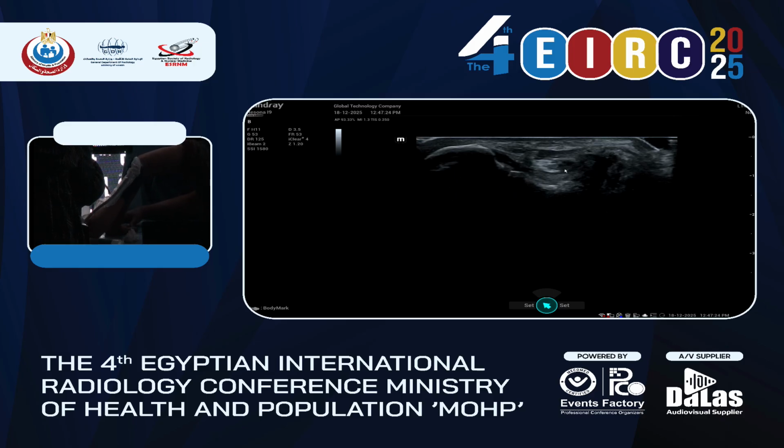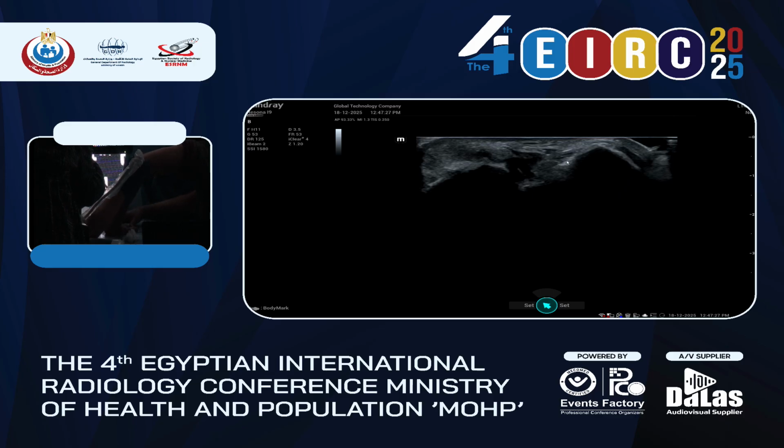You see here the ulnar nerve, and at this level, the ulnar nerve is stabilized in the entrance of the cubital tunnel by a ligament which is called the Osborne retinaculum. The Osborne retinaculum is lying exactly at this area here. It is an echogenic line lying on top of the nerve. And also we might have some part of the triceps muscle extending into the entrance of the cubital tunnel. At this level, the presence of the Osborne retinaculum is very important, because it stops the ulnar nerve from subluxating. So at this level, the ulnar nerve is this structure here.